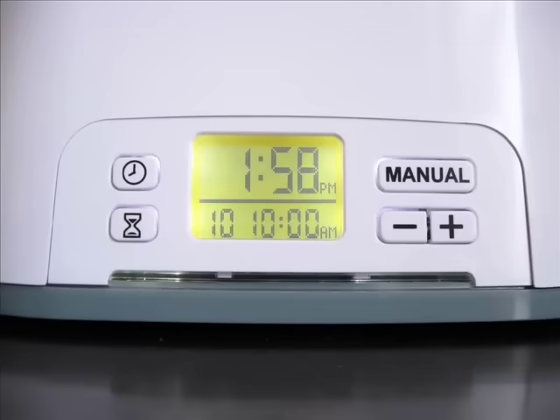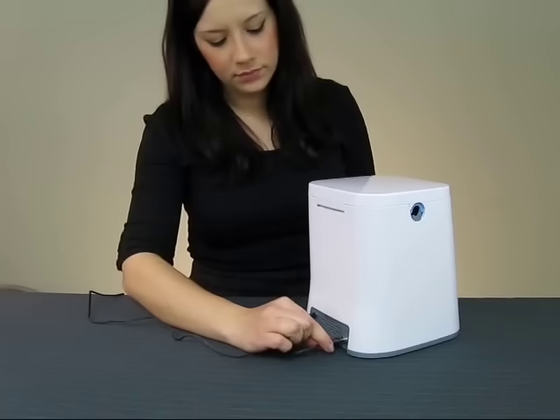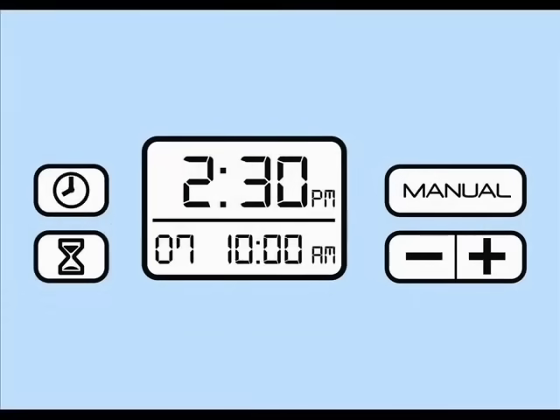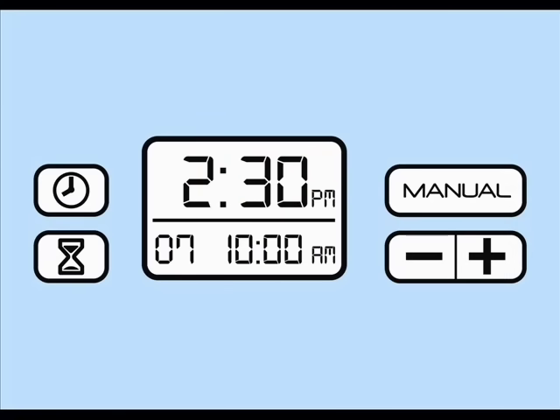To set the SoClean timer, power up your unit by plugging the AC adapter into the back of your SoClean and then into a wall outlet. Now, set your clock by pushing the button with the clock icon. This will prompt you to set the current time by pushing either the plus or minus button until your current time is reached. Then, push the clock button once more to store your time and to return to the home screen.